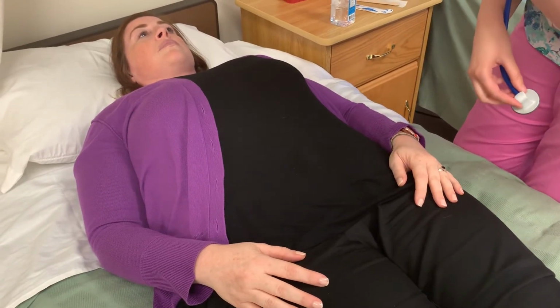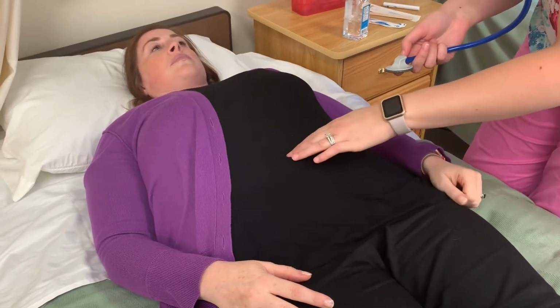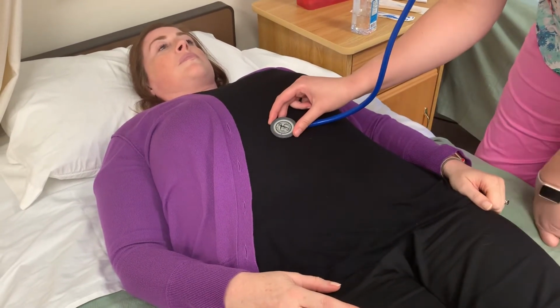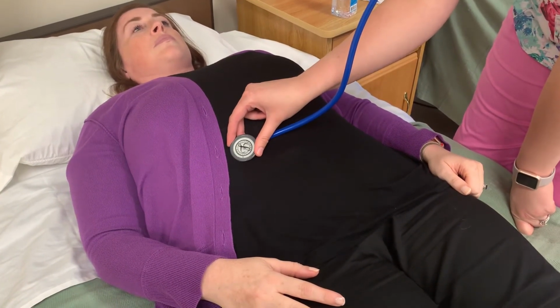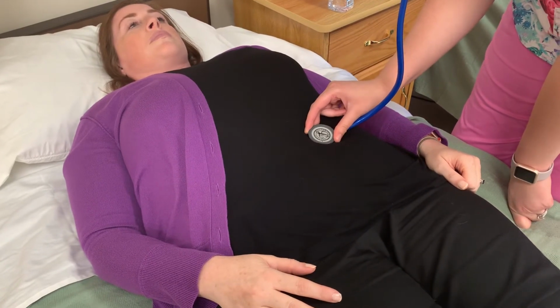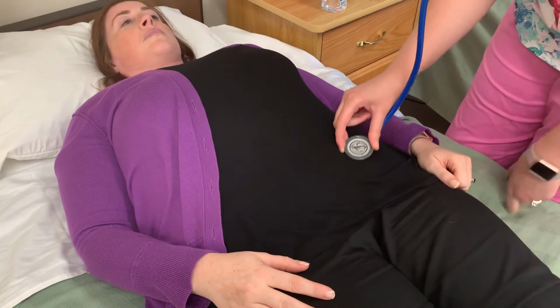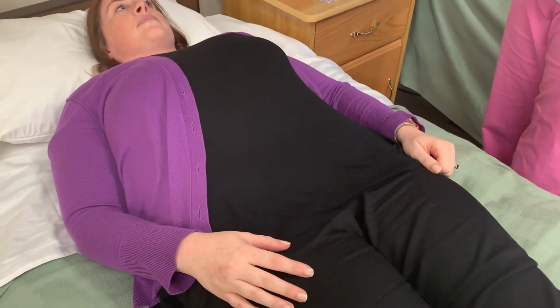Shannon, can you point to me where your belly button is at, please? Perfect. I'm going to listen to vascular sounds or bruits in your abdomen. So I'm going to start up here with the bell of my stethoscope at the aortic. Then I'm going to move down to renal, iliac, and then femoral. And I did not hear any bruits in your abdomen, which is normal.